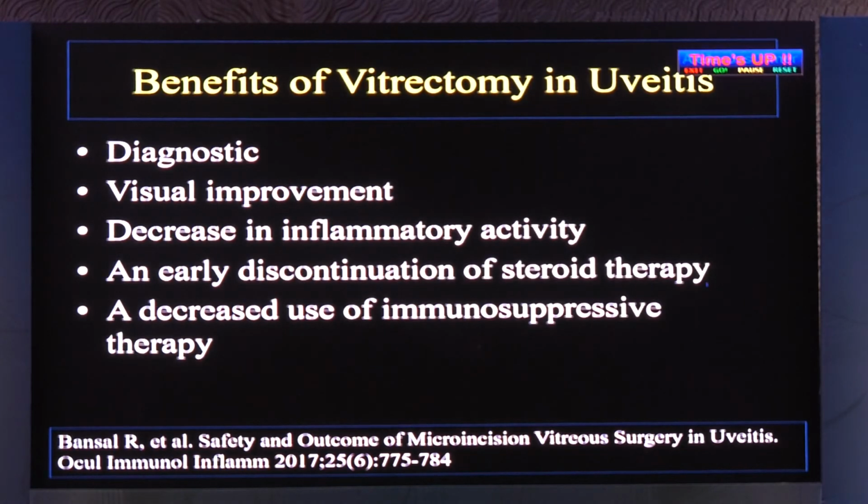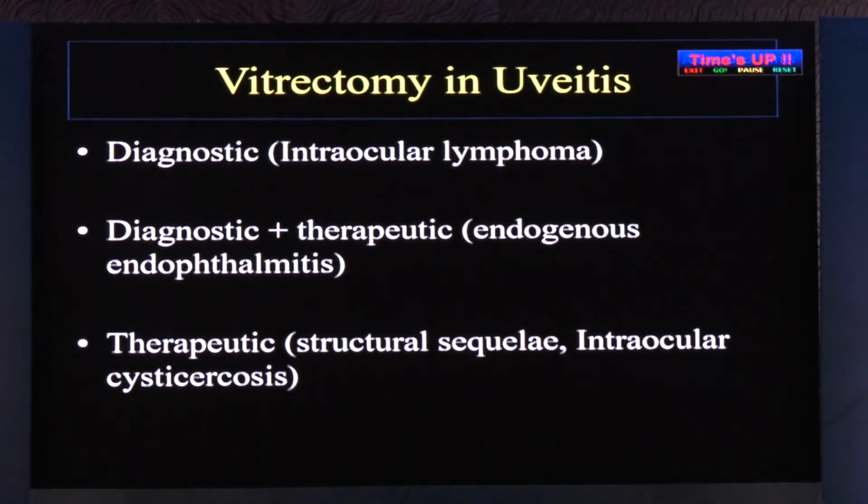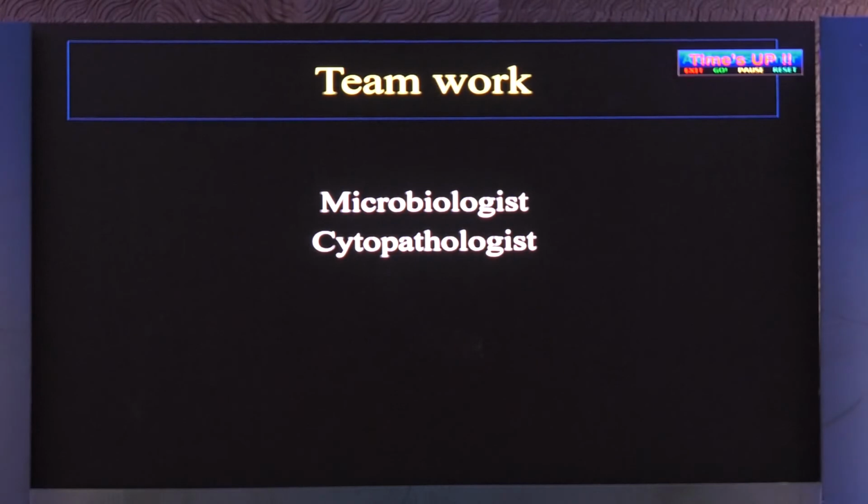So benefits of vitrectomy are not only diagnostic but also therapeutic. So microincision vitreous surgery is safe and efficacious and should be carefully planned in these patients. Clear plan by the ophthalmologist, and basically I would say it's a teamwork between the ophthalmologist, microbiologist, and your cytopathologist.